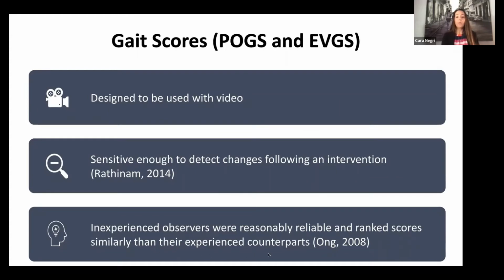Now, this is important for me because we're part of the Baylor residency program, and our residents are wonderful, and they are able to jump in and do these scores, and we often compare. So the resident will do a score and I'll do a score, and we'll compare and discuss it and we'll debate and come to a conclusion, maybe say that, you know, maybe we didn't see vaulting. Let's remove that one. So it's a really great way to engage residents or inexperienced observers.